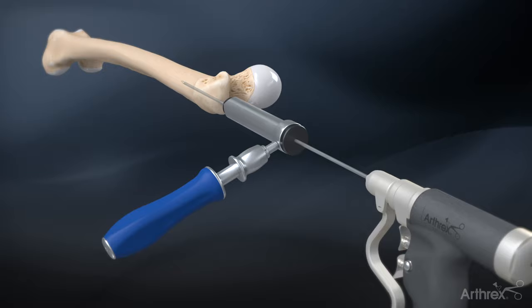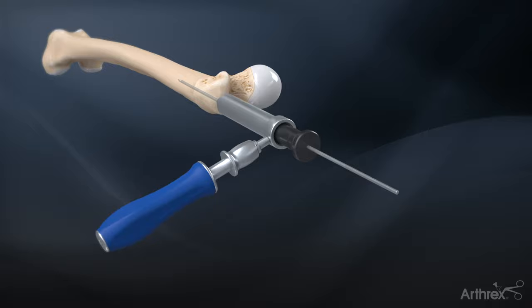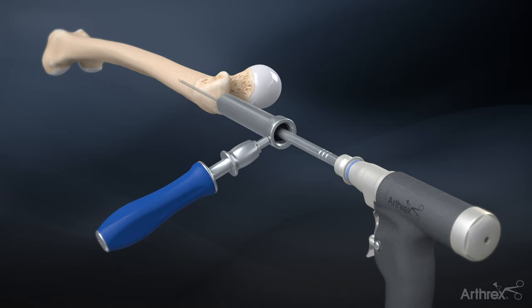Insert the 3.2 mm guide pin through the soft tissue protector by aiming towards the central axis of the femoral shaft. Remove the black pin guide and ream over the guide pin with the 13.5 mm cannulated entry reamer.